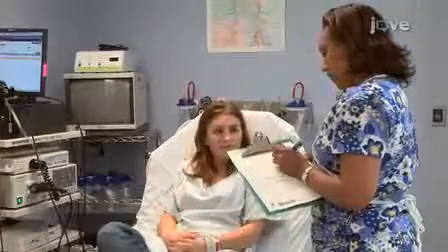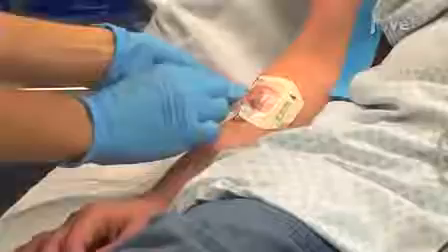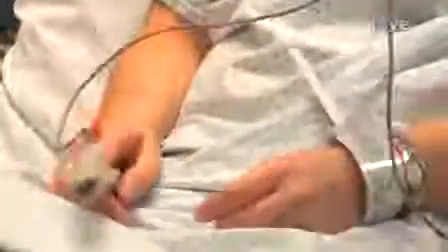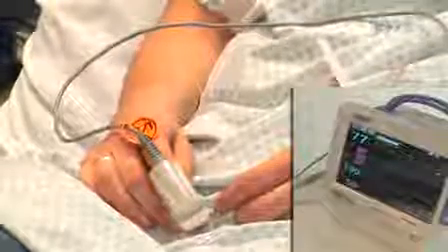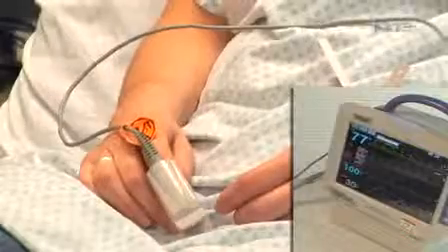After the patient's chart is reviewed, the patient is prepped and a peripheral intravenous line is placed. The patient is given supplemental oxygen via oral or nasal cannula and is placed on appropriate monitoring for sedation. The patient is monitored with continuous electrical cardiac or EKG monitoring, continuous pulse oximetry, and intermittent non-invasive blood pressure.